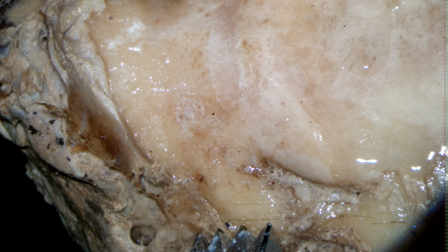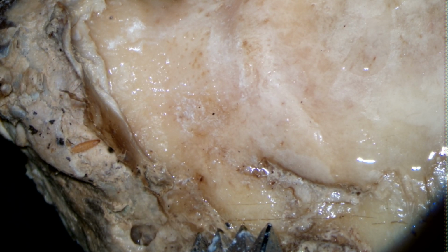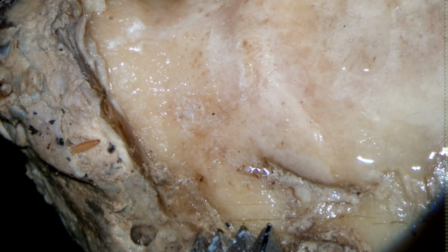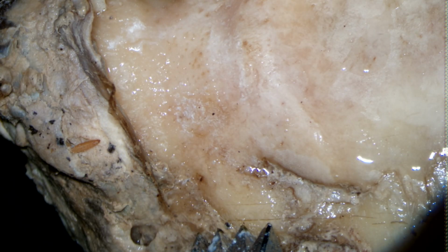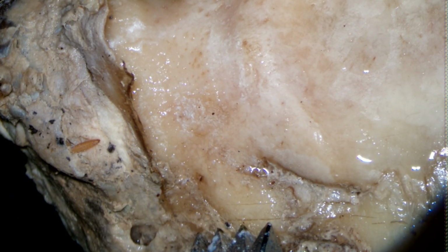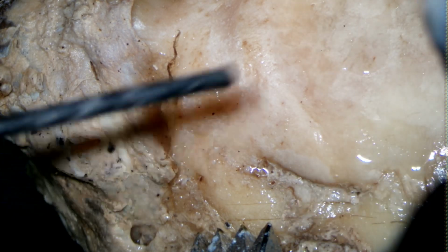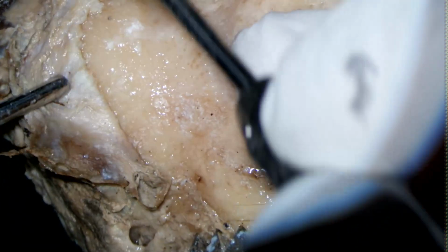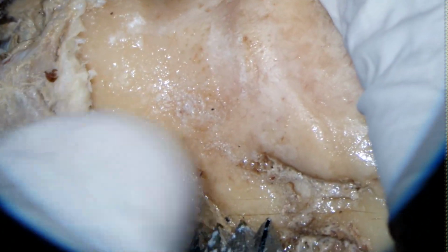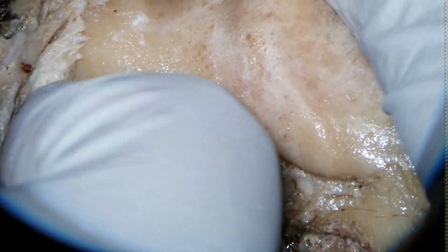So the points to remember while opening the mastoid antrum, basically doing the cortical mastoidectomy, is that we should not damage the dural plate and the sinus plate, right?